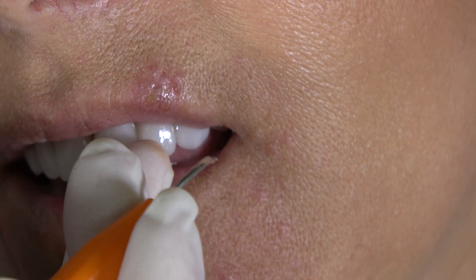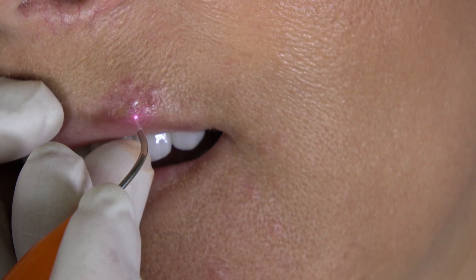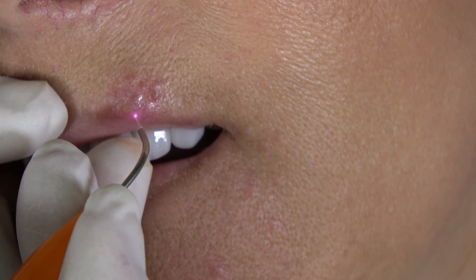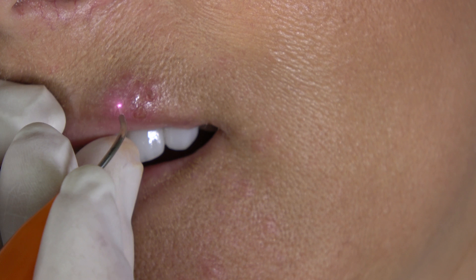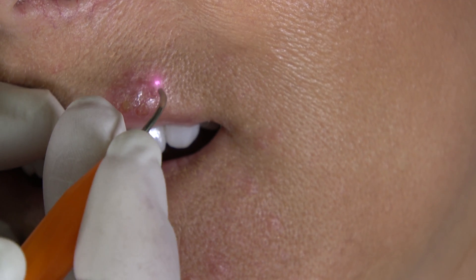Let's bump it up another tenth of a watt. Do you feel that much? Hot. So our sensation is of warmth or heat, which I would expect.